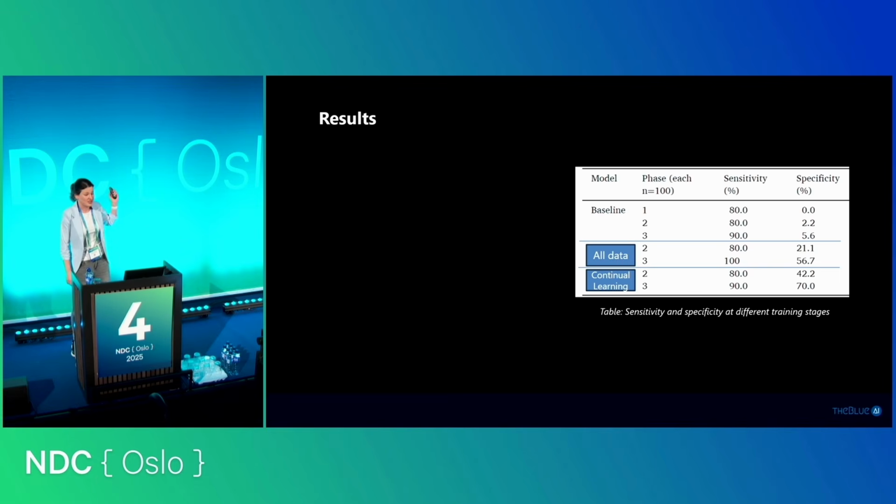But it still had very low specificity, which we saw in the old data. Even though we have already changed the data distribution here, it still recognizes the FCDs very well, having 8 and even 10 out of 10 FCDs correctly recognized. And it is already getting much better on specificity, which we can see has increased to 56.